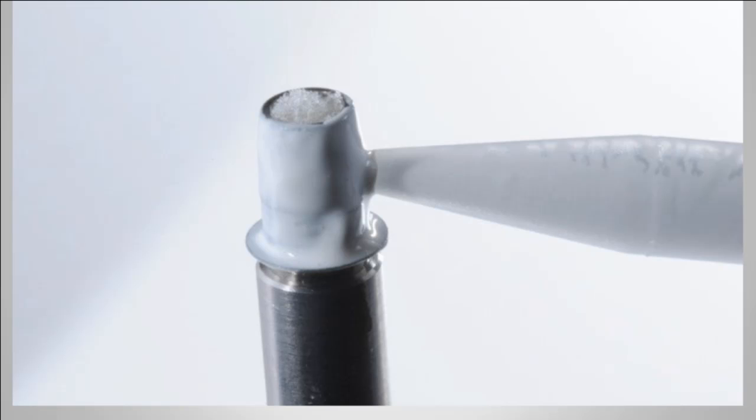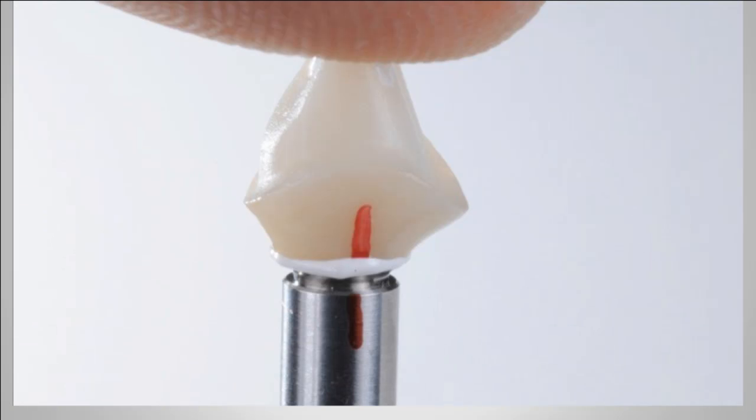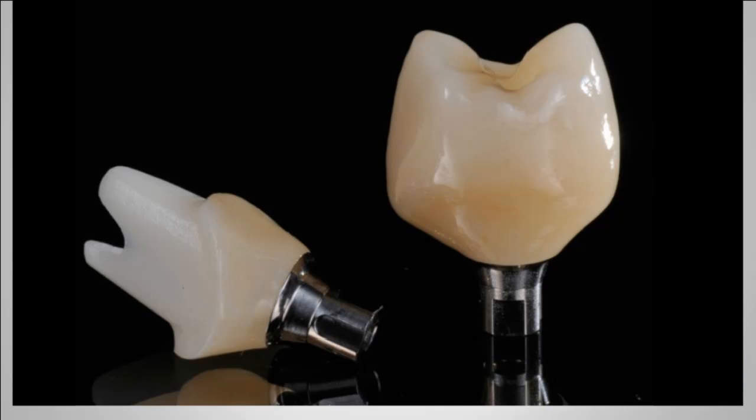But it's heavily coating the tie base itself. And once it's been coated, the clinician can actually coat the inside of the abutment or the crown and line the components up correctly as you see here. Once the components are lined up, this material takes 7 minutes to fully cure and set. Once it's set, we can take a rubber wheel and polish off any excess cement, essentially creating either a separate abutment or a screw-retained crown, ready to be seated.